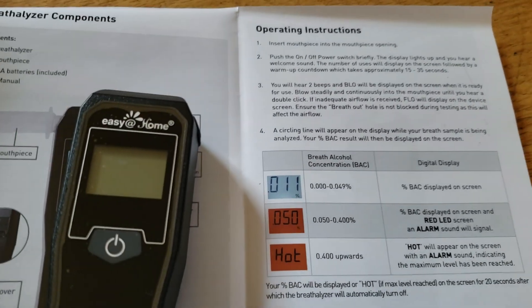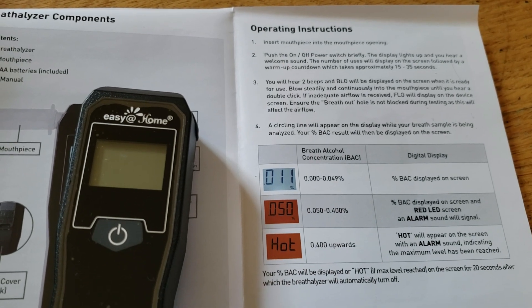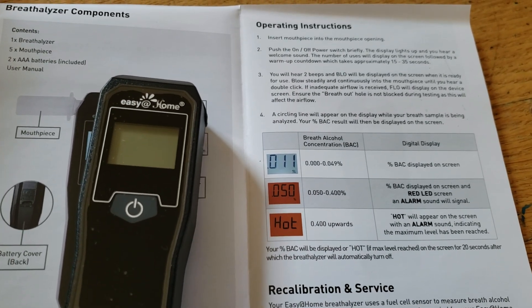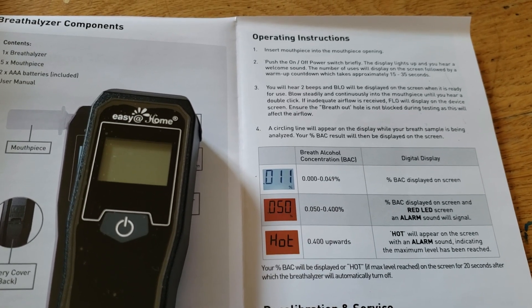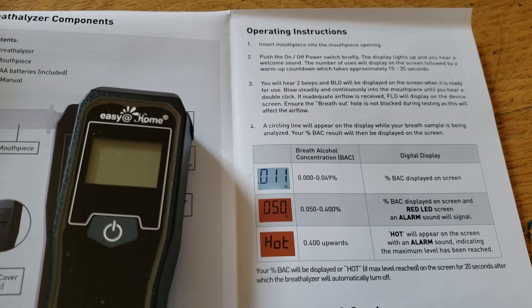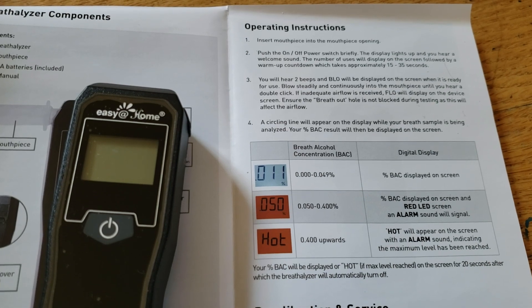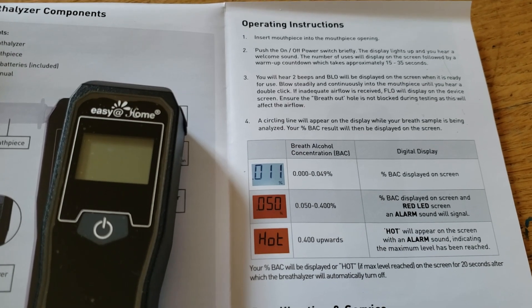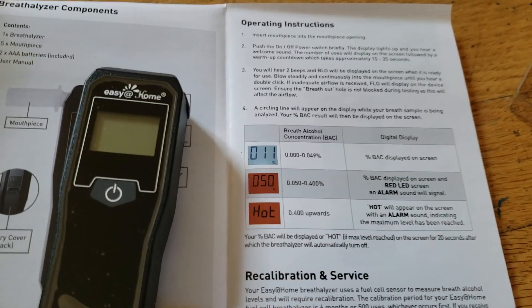Push the on/off button and the display lights will light up, and a welcome sound will come — you will hear two beeps. BLO will be displayed on the screen when it is ready for use. Blow steadily and continuously into the mouthpiece until you hear a double click. If there is inadequate flow, FLO will display on the device screen — ensure the breathe-out hole is not blocked.